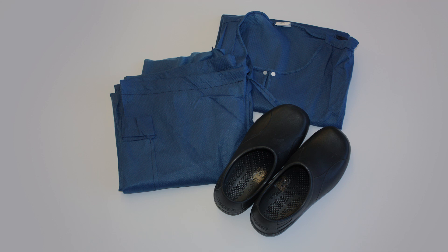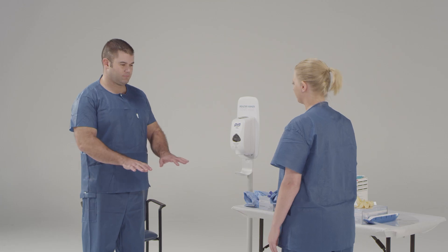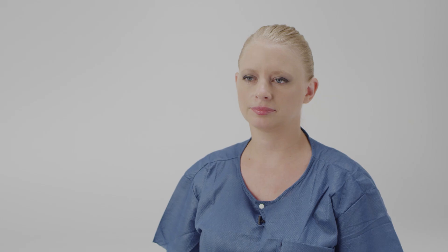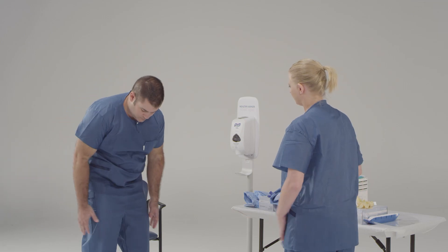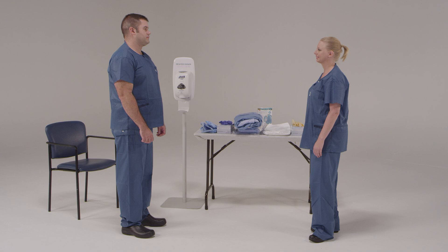Before starting the donning procedure, change into clean surgical scrubs or provided disposable garments and dedicated washable footwear, such as plastic or rubber materials, in a suitable, clean area. All footwear should be closed toe and closed heel with no holes. No personal items such as jewelry, watches, cell phones, pagers, or pens should be brought into the patient room. Ensure hair is pulled back, away from the face, and off the neck and back. Ensure that your nails are no longer than a quarter of an inch so they do not puncture the gloves.